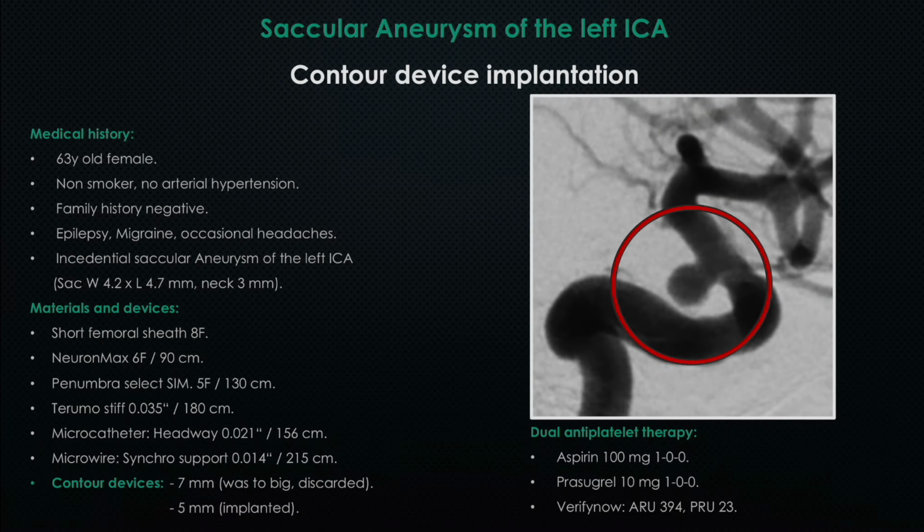Hello, dear colleagues. My name is Al-Muhammad, and today we have a saccular aneurysm of the left ICA, which we've treated with a contour device.